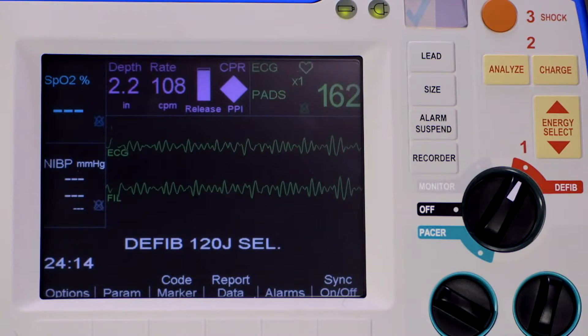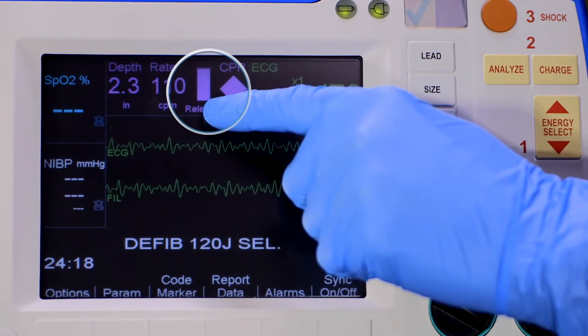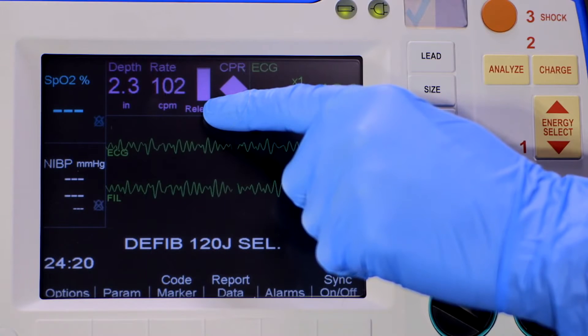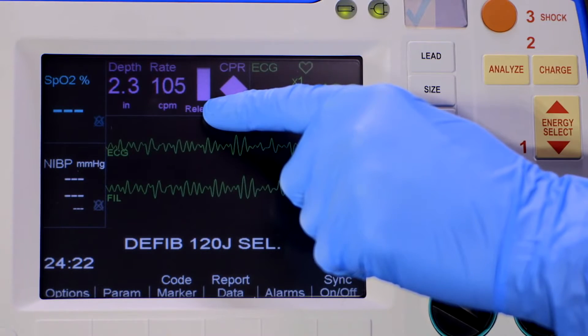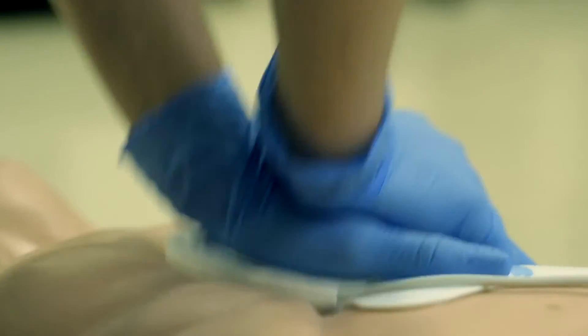The release bar measures release velocity to determine that rescuers are allowing sufficient time for cardiac filling. The bar should be completely full of color. If the color begins to decrease, make certain the rescuer is coming completely off the chest for full recoil.